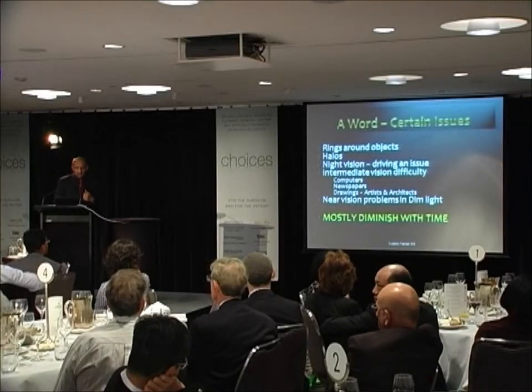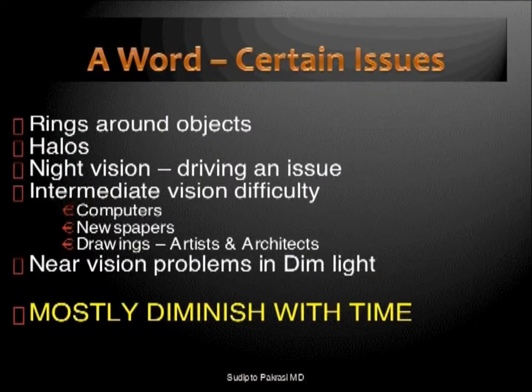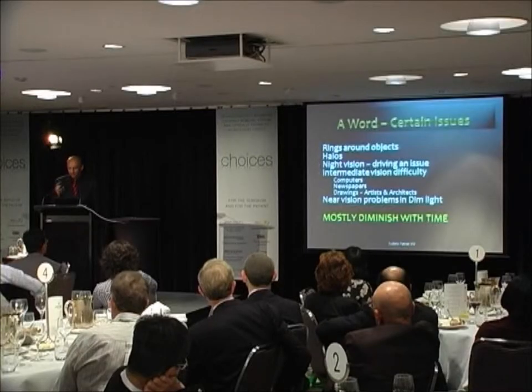And what we have found as issues with this lens over our last 15, 16 months: rings around objects, halos, night vision, driving is an issue, intermediate vision difficulty like those I mentioned earlier, and near vision problems in dim light. These are issues which people have complained about. Different percentages are there. I'm not here to present my data, but we have had very few people who have been extremely unhappy with this lens. So mostly they diminish with time.